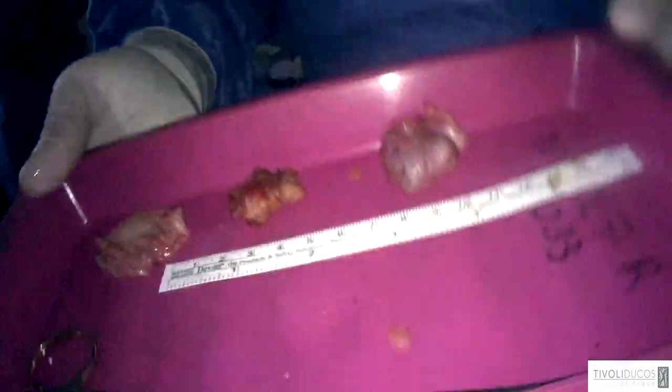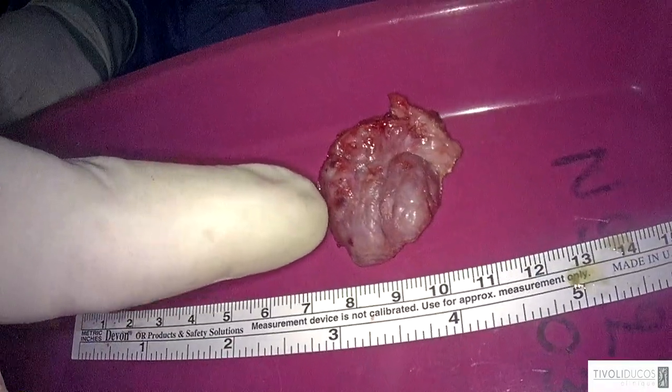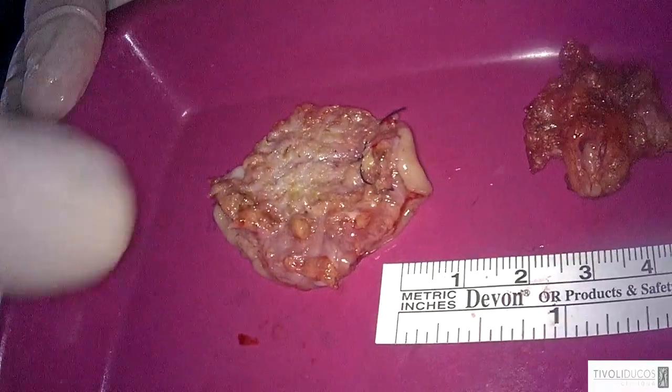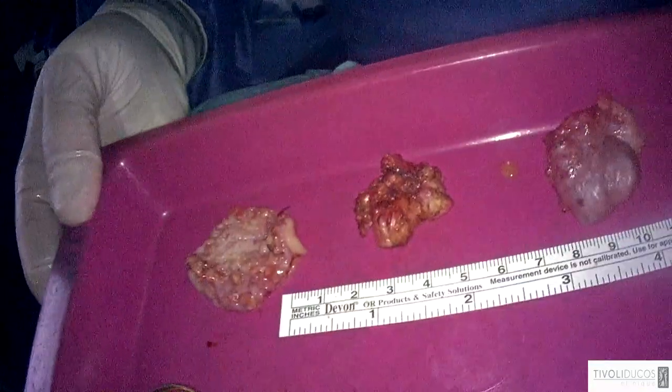So here we are less likely to carry out the stoma. This is the vagina, you see. It's a big 3 centimeter vagina. This is the parametrium, and this is the rectal patch. Together, they result in the rectovaginal nodule we removed.